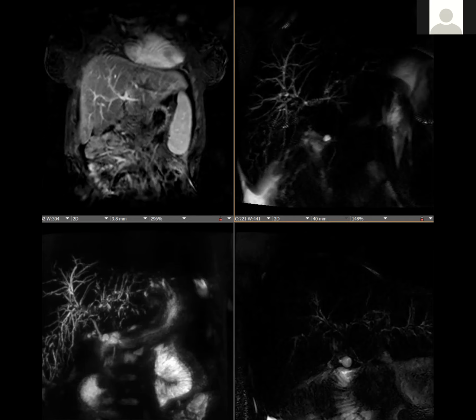I'm not sure if the patient had PSC originally. Sorry, I can look it up. But this isn't PSC. To me it looks like there's some central disappearance of the ducts. Yeah, exactly. So what do you think? Some kind of cholangitis, it could be immune related, there could be PTLD. I don't know if IgG4 is more common post-transplant.